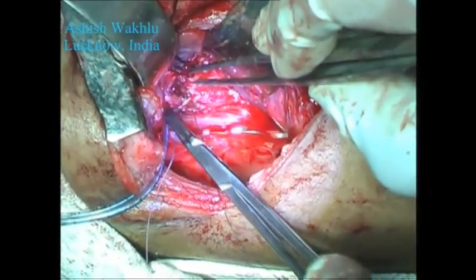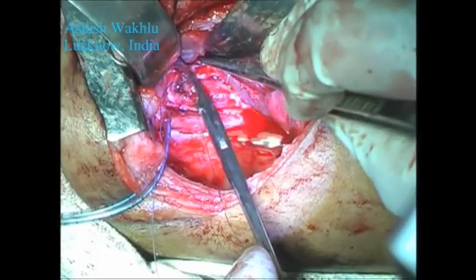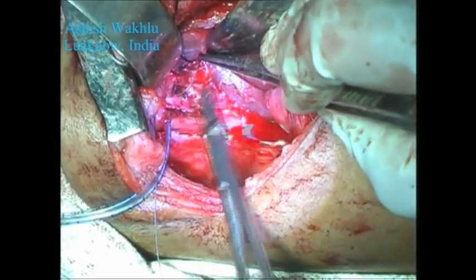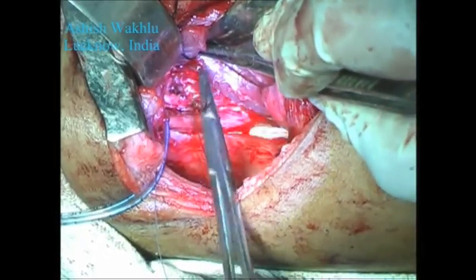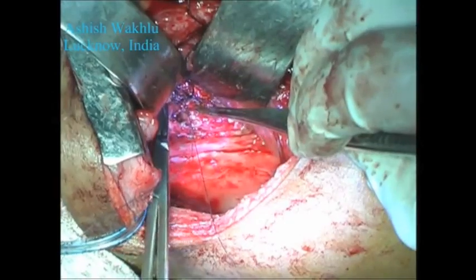We can see the two front walls coming together there. The sutures are again going from outside in the bronchial stump and inside out in the bronchial bifurcation.